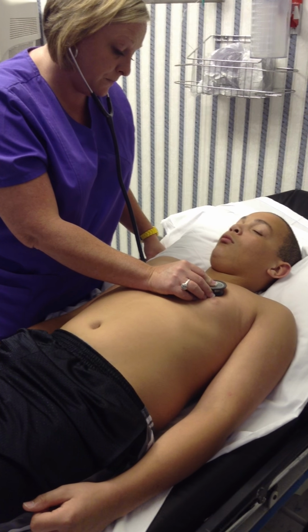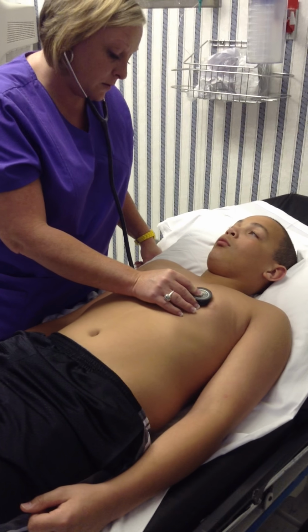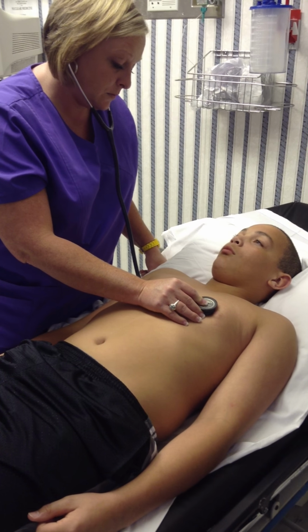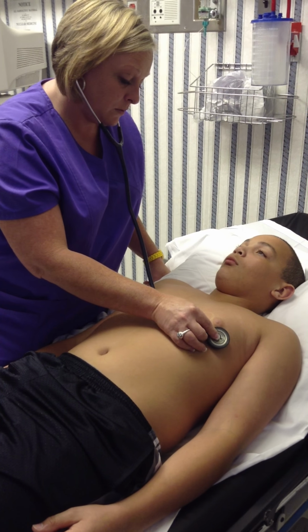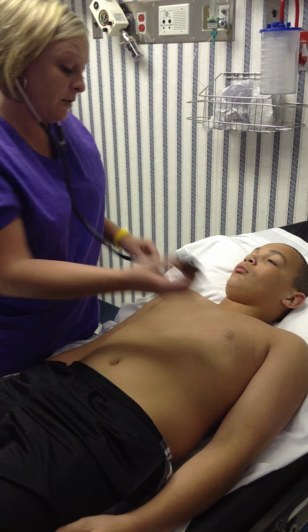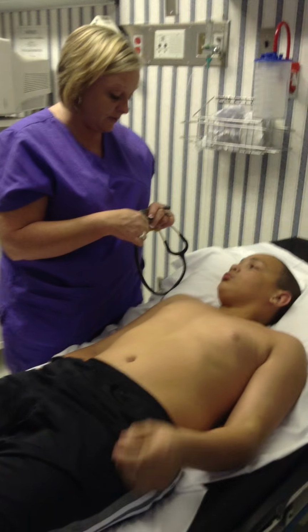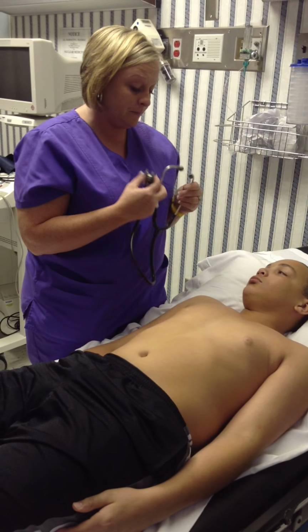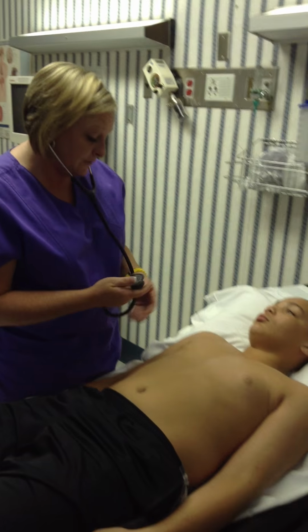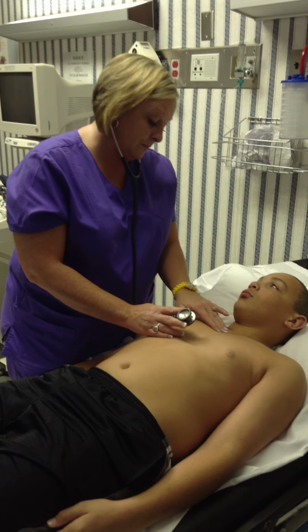Erb's point, mitral, apex. Okay. Now, Micah, next I'm going to swap it back over and use my diaphragm. Okay. I'm going to start off with the aortic.